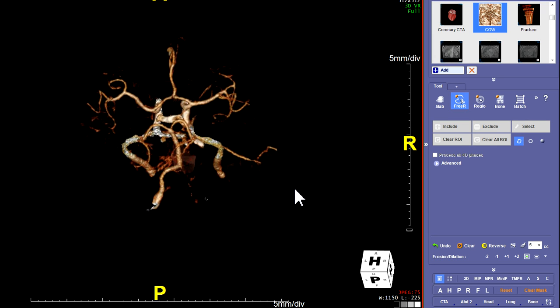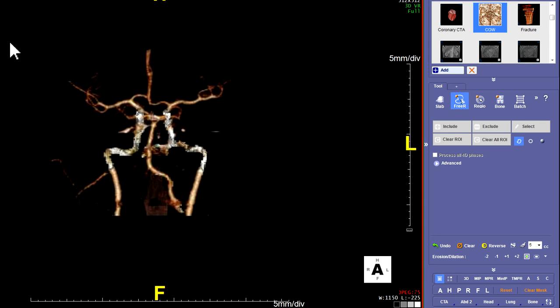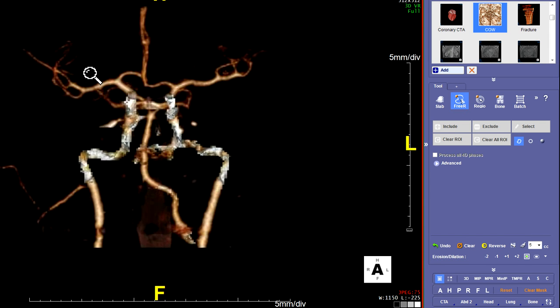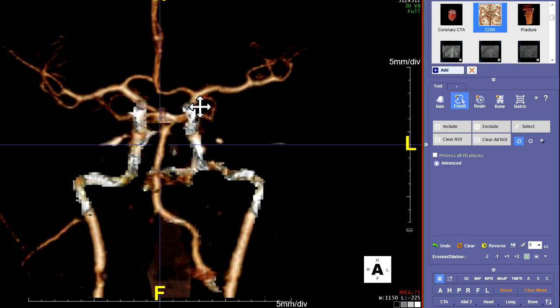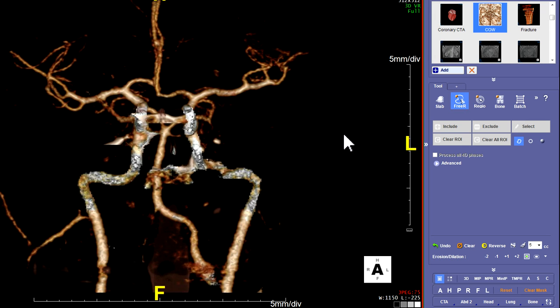Now we're going to film out this 3D cap. Start from the anterior view — all of these are going to start from the anterior view. Zoom it up nice and big, fill the whole frame with it. I'm about to run out of time, so I'm going to stop this video and then we'll go to another video for the rest.